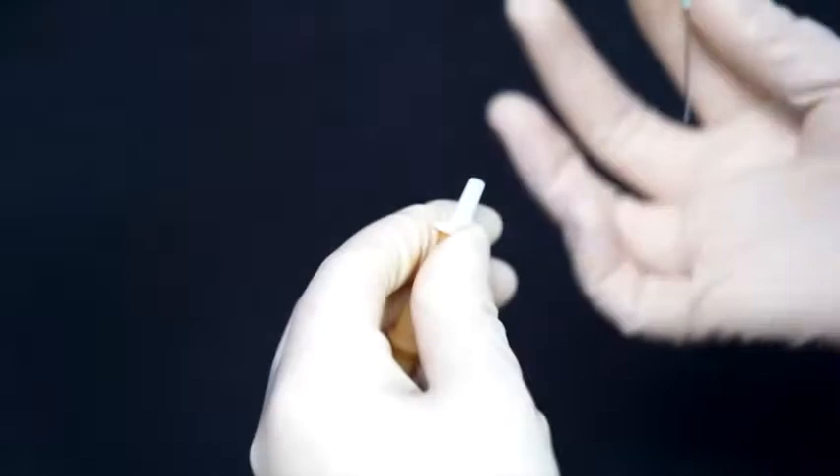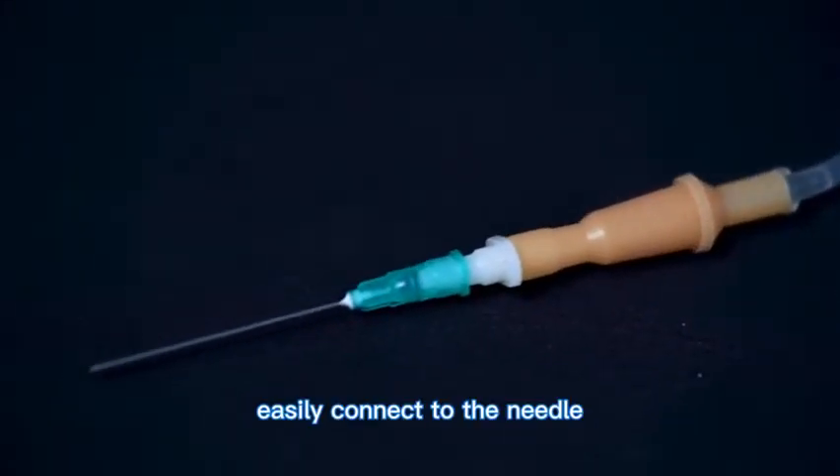4. Lure lock connector meets international standards and easily connects to the needle.